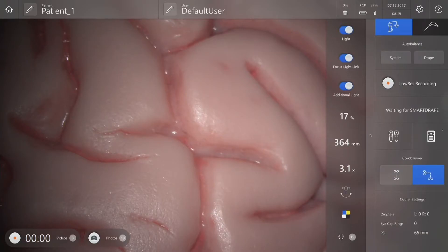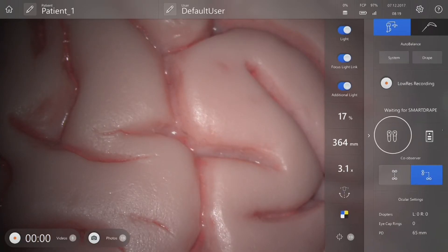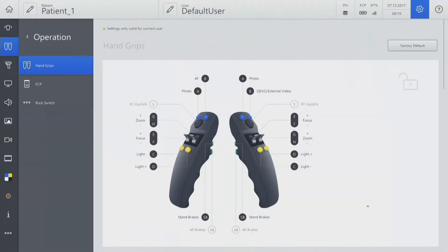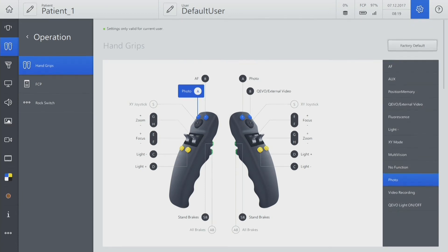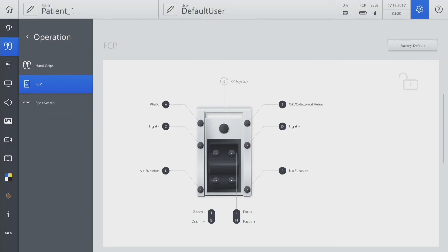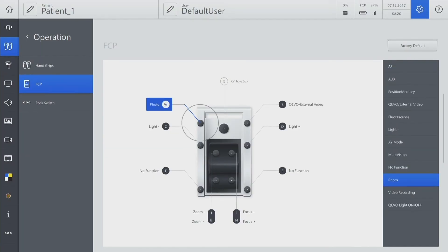We can ensure that the handgrip and foot control panel are also configured for Multivision. For this case, we will configure Multivision on the left blue button on the left handgrip. Similarly, configure the top left button on the foot control panel for activating Multivision.